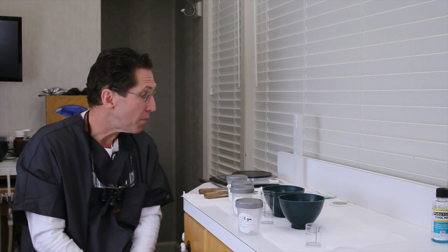Again, my recommendation to you is start with the measurements we're giving you here. Try them yourself. If you want to vary, if you want to set a little faster, raise the temperature. If you want a little more working time, lower the temperature. If you want to increase or change the viscosity, you can adjust. But these are, I will tell you from lots and lots of years of experience, very good working ratios. And this is where we really want to begin. And so with that, we would like to move forward into our next segment and actually show making the impressions.